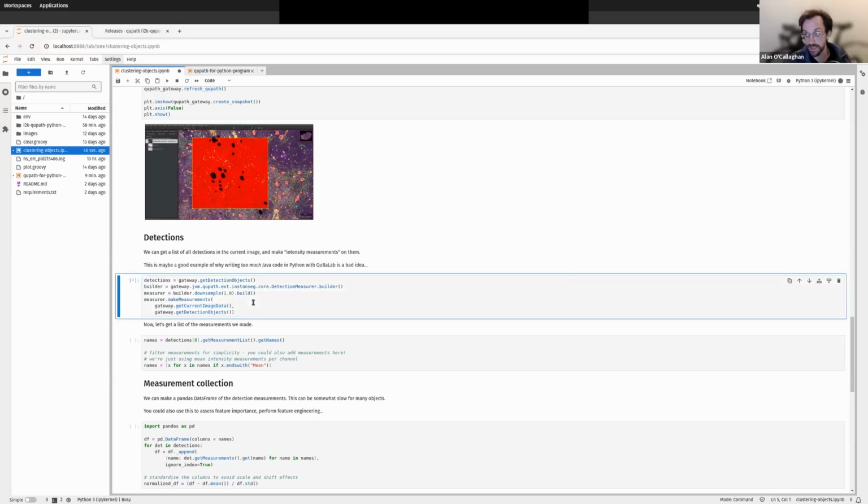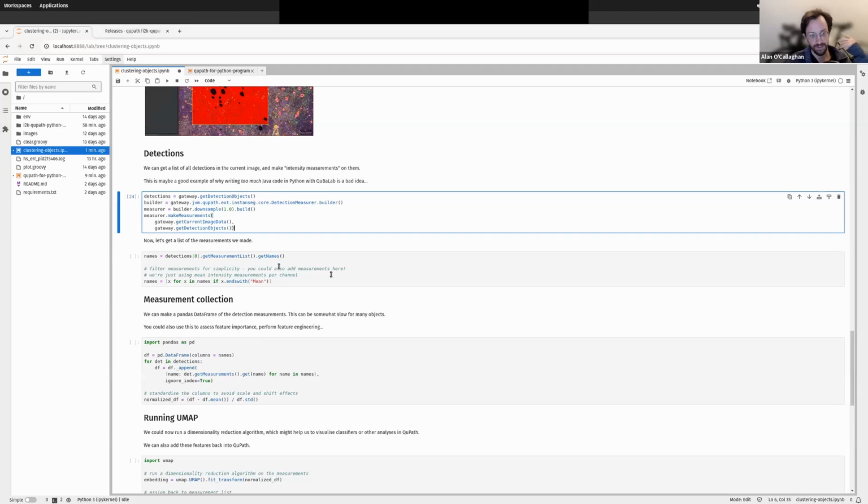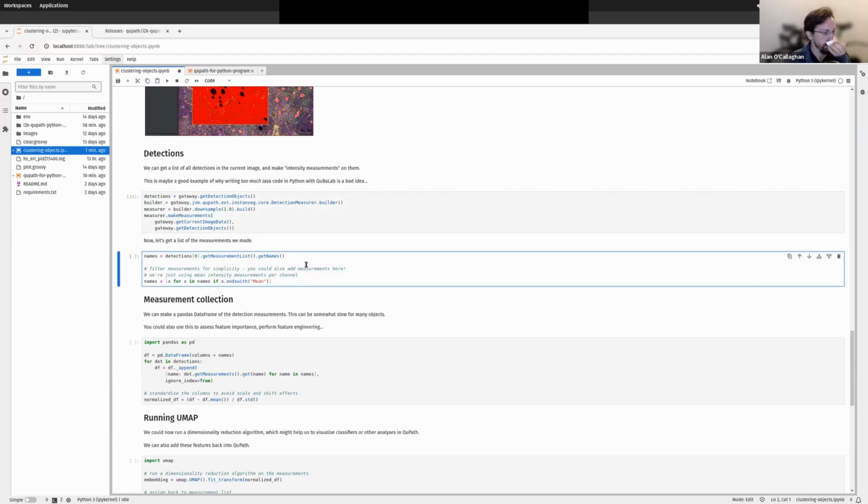And this is kind of what I was saying earlier, in that you can write fairly complex code mixing Python and Java, but it's probably not a good idea most of the time, because it's going to end up very convoluted like this. That's very fragile code, basically, and quite convoluted in that you're usually going to have to create or get handles on Java objects rather than working in the Python world. But for this workflow, it works quite well.